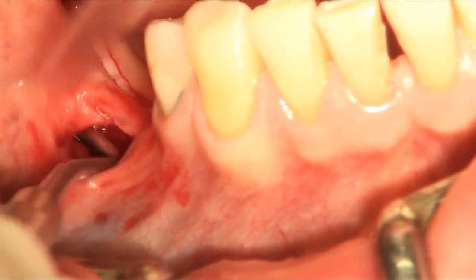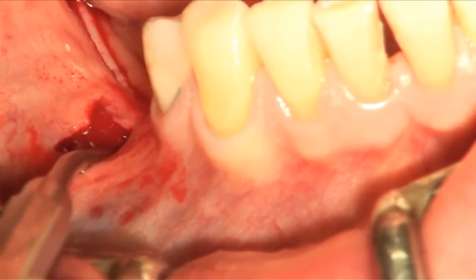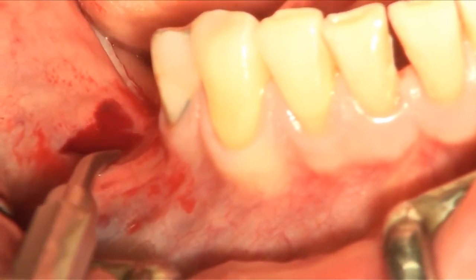And as soon as the template fits into the pouch, our preparation is finished.